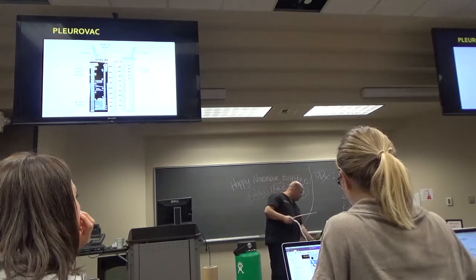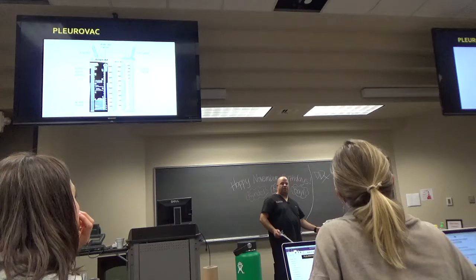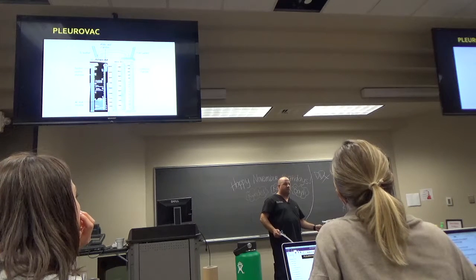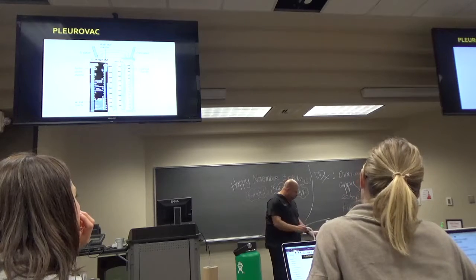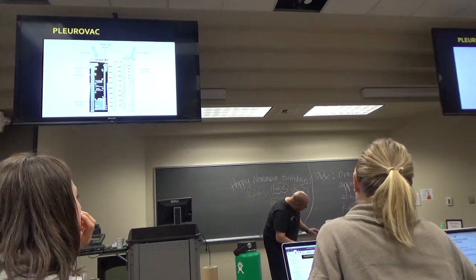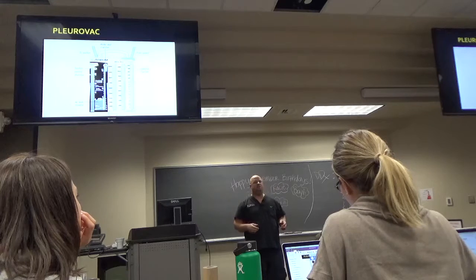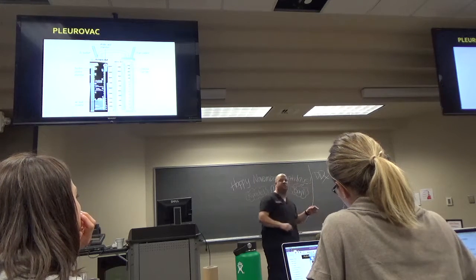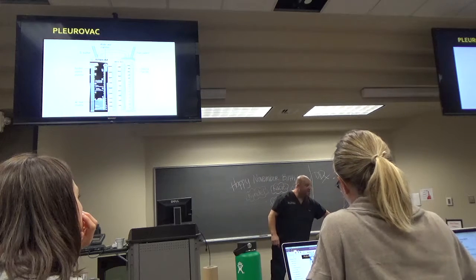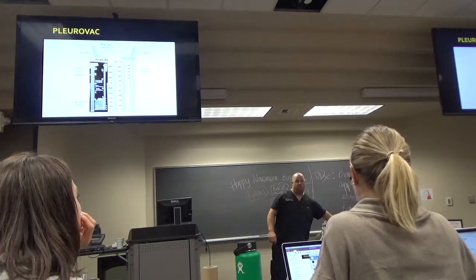This back here is a cell saver. So if somebody has a couple of liters of blood in here, they can auto-transfuse it back to themselves, okay? Anesthesia can do it in the OR. When I put a chest tube in, I mark how much came out. Say I put the chest tube in and I got 400 cc's of blood out. I'll mark my name and my initials and the time of when that happened.